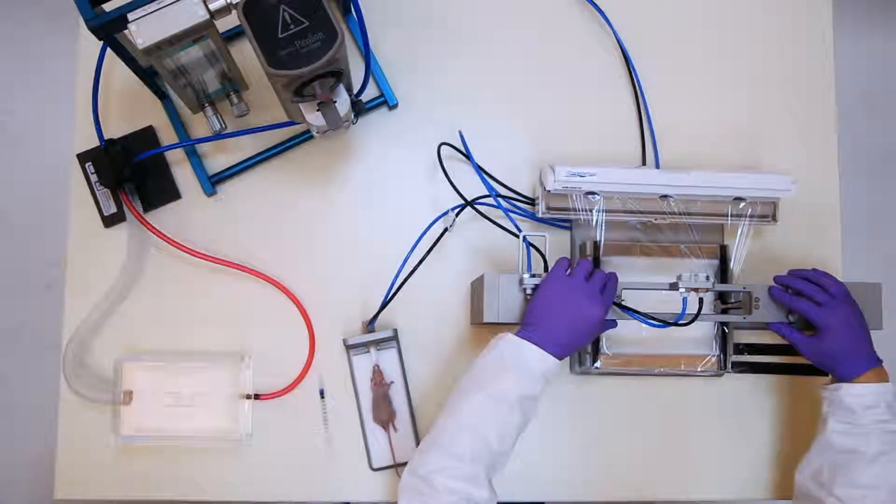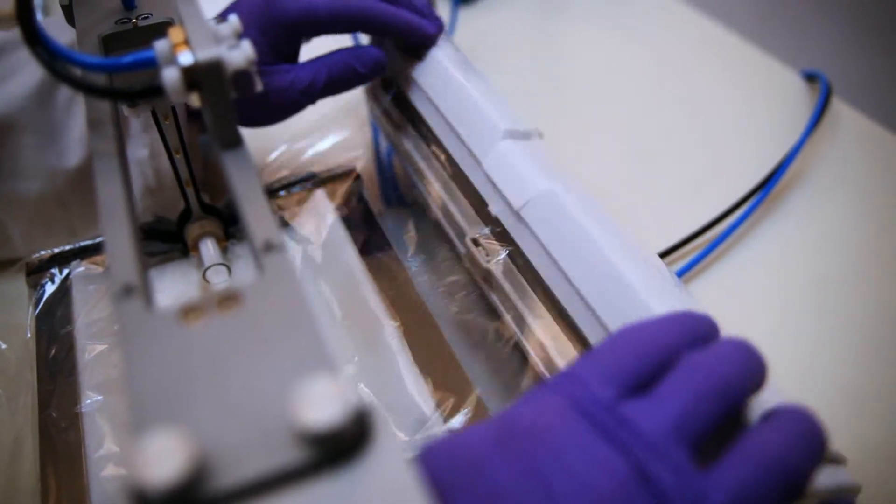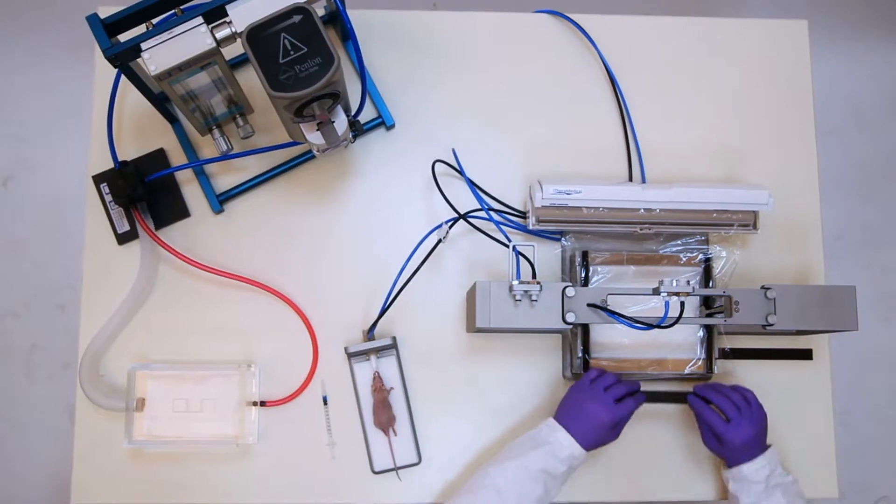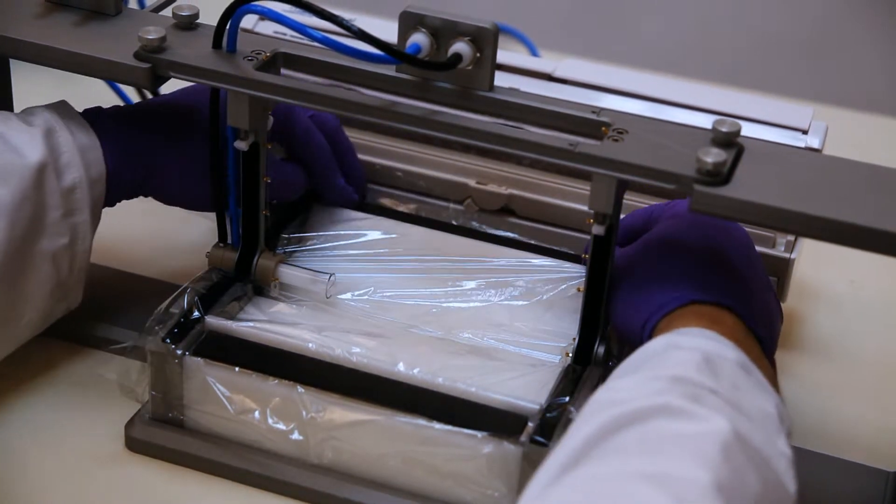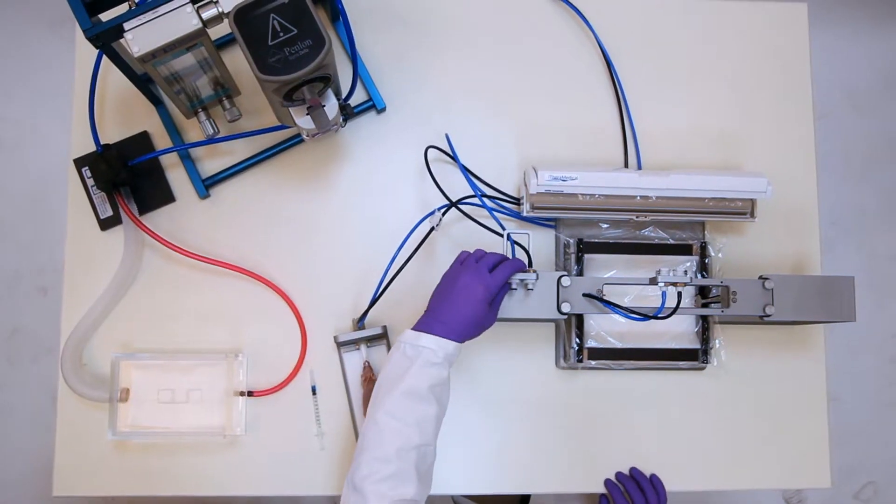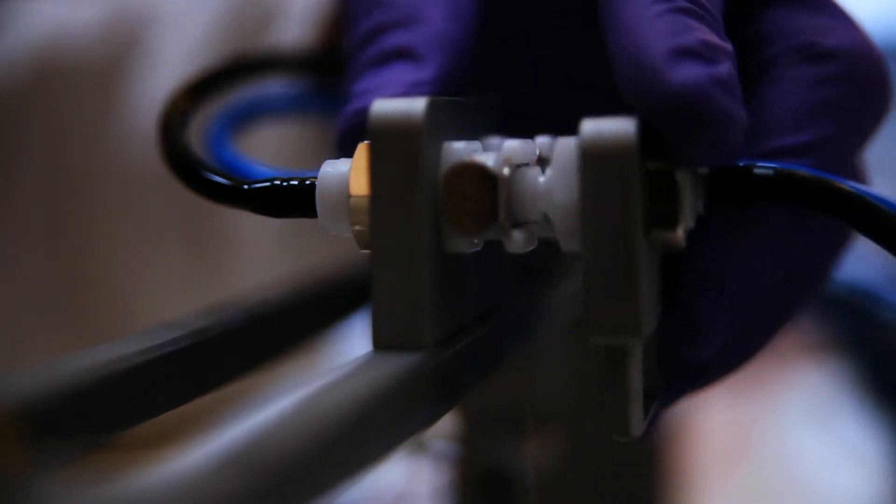The animal holder is placed into the preparation station and the membrane is attached to it. Anesthesia is then switched from the injection platform to the animal holder.